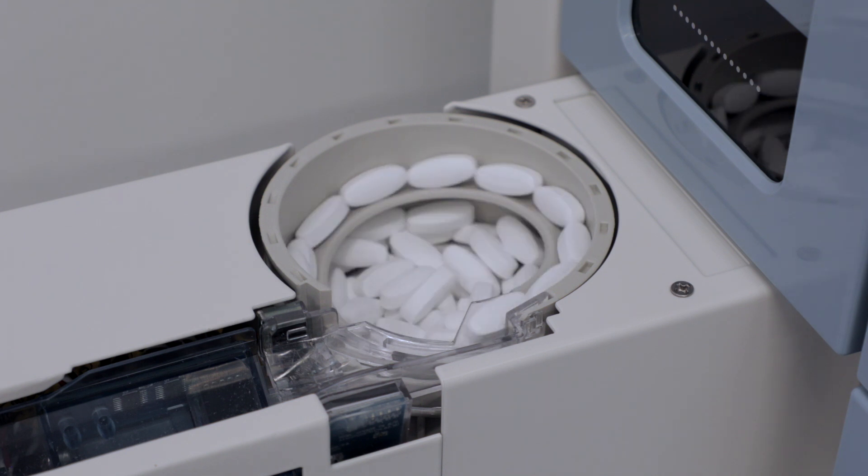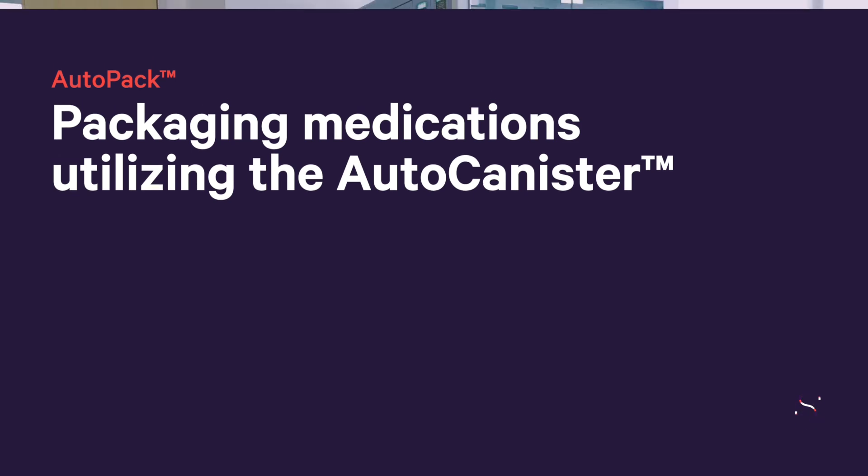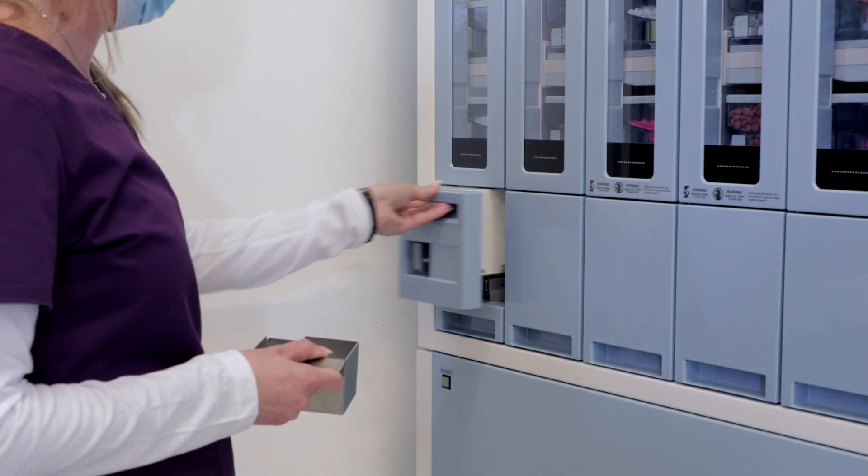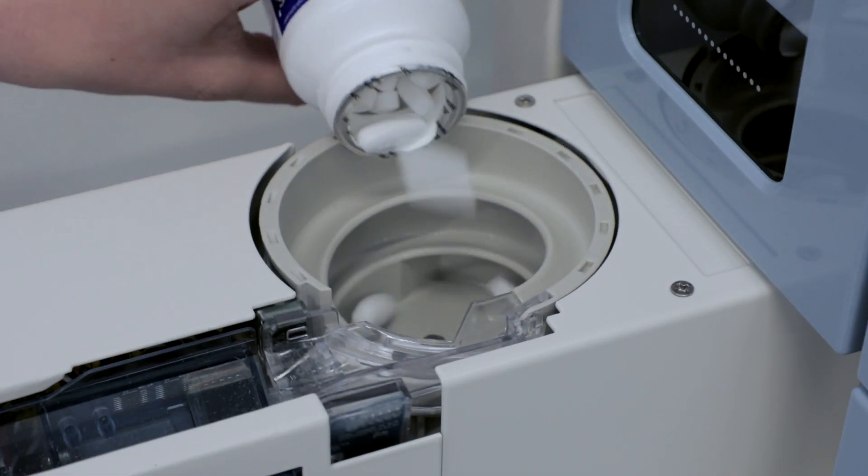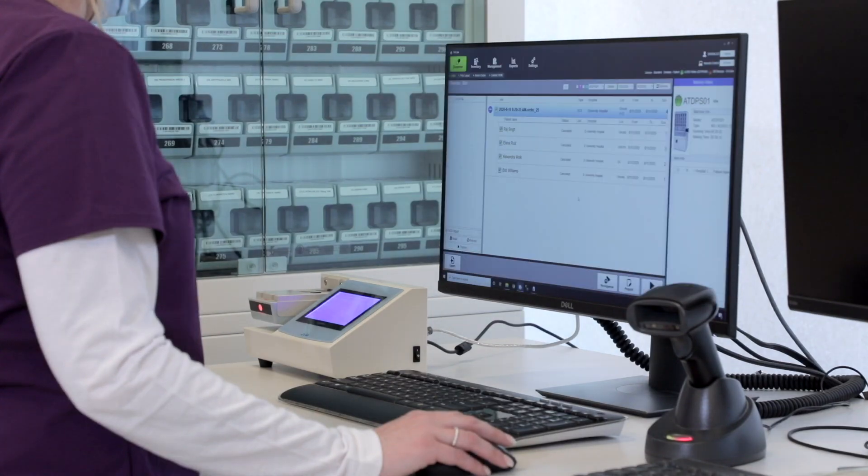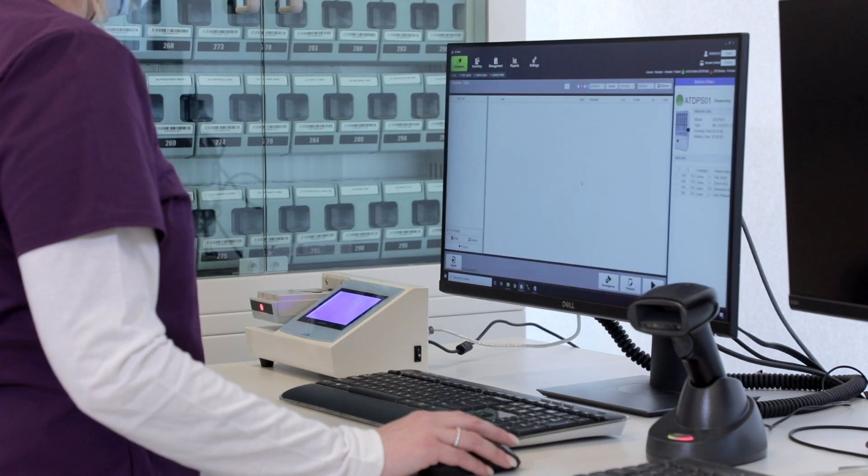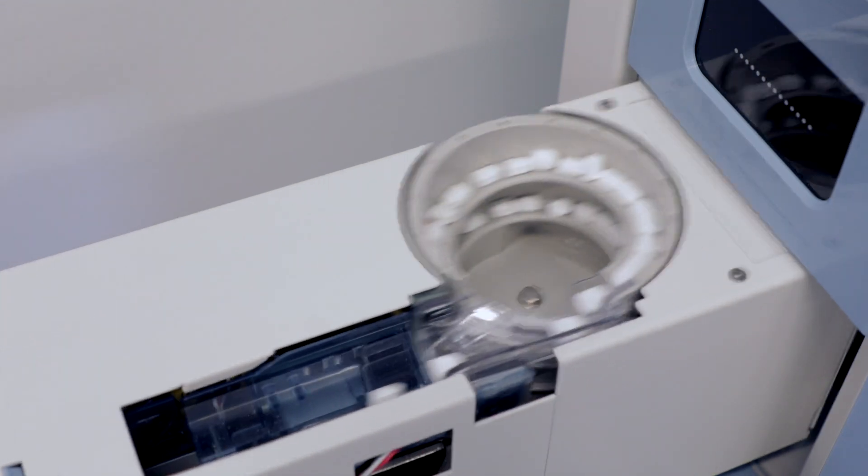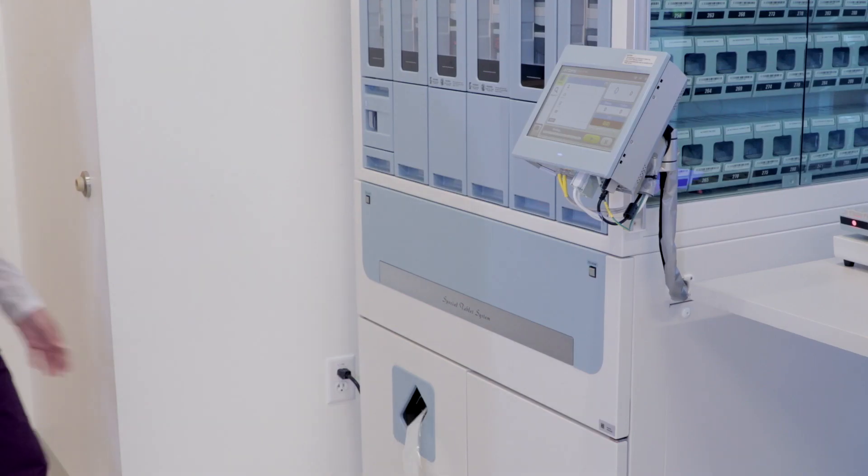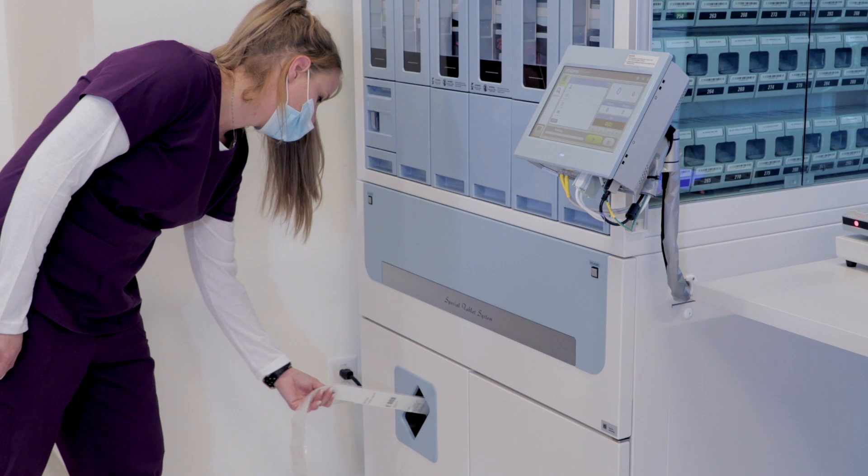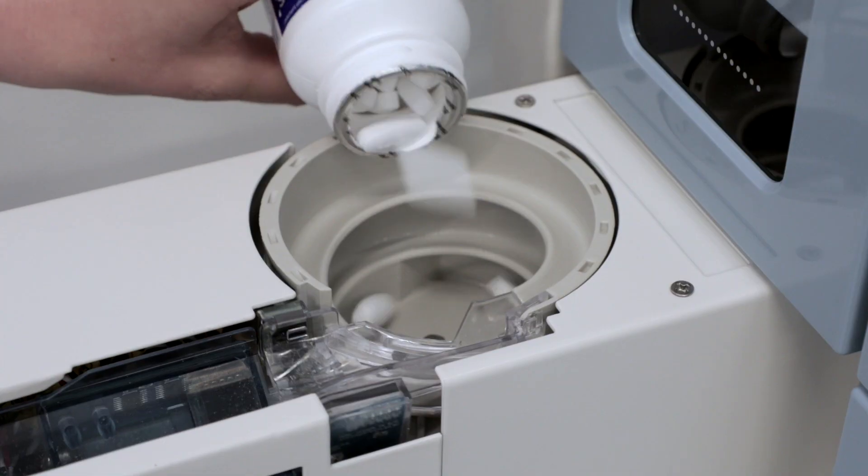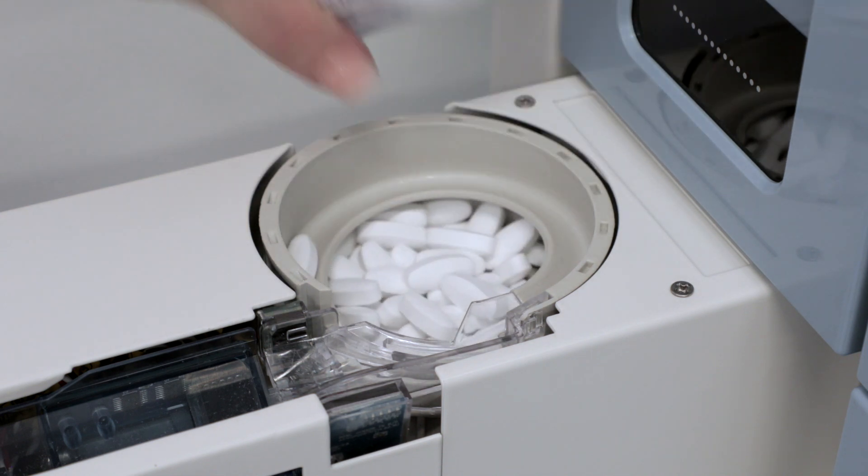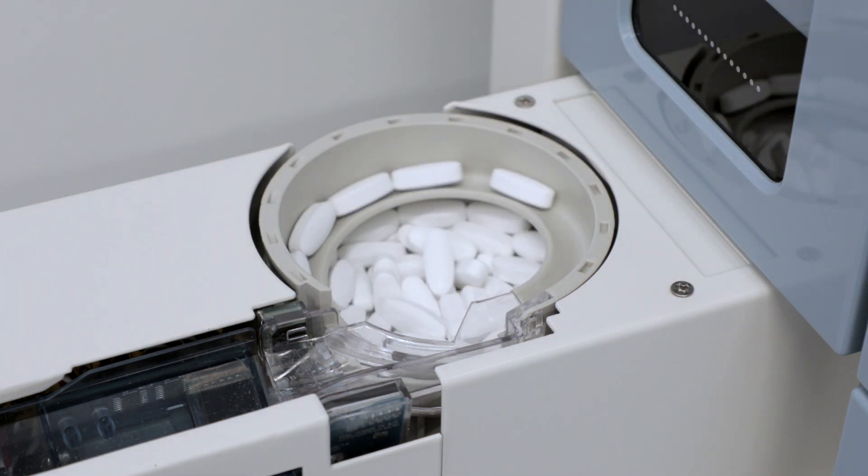An auto canister automatically and quickly packages oral solid medications and accommodates up to 500 tablets at a time. Depending on the model, up to four AutoCanisters can be added to one AutoPak Packager, taking the place of three or four standard canisters. The AutoCanister is a great solution for packaging medications that have frequently changing NDCs, as there is no need to recalibrate a canister or wait for a new canister to be ordered.